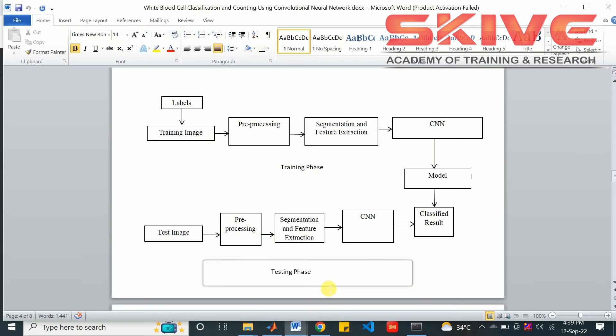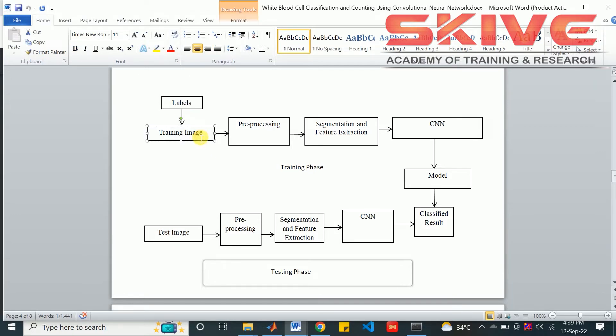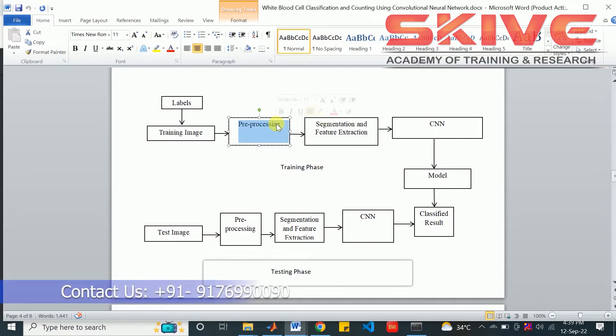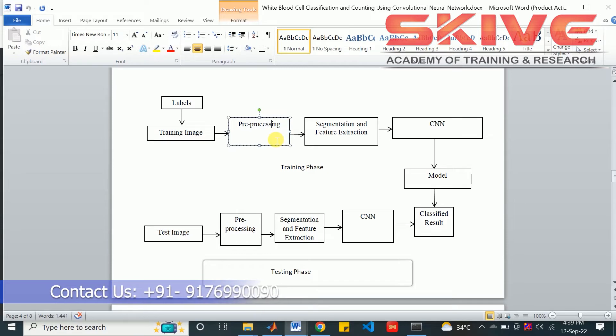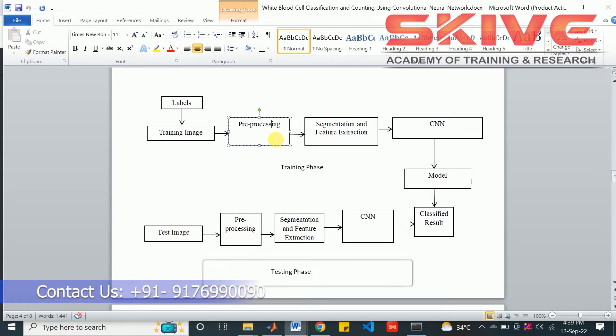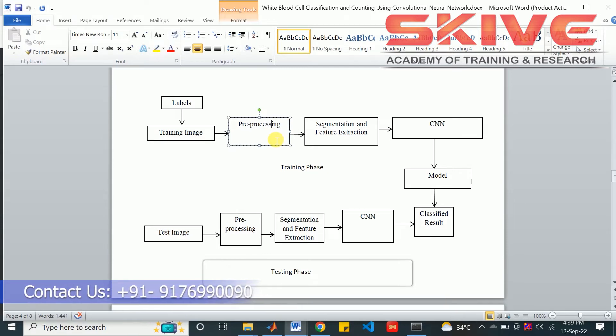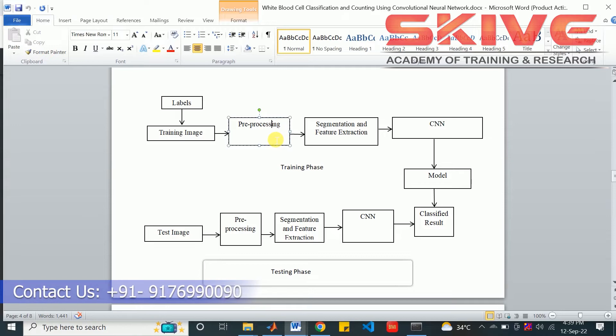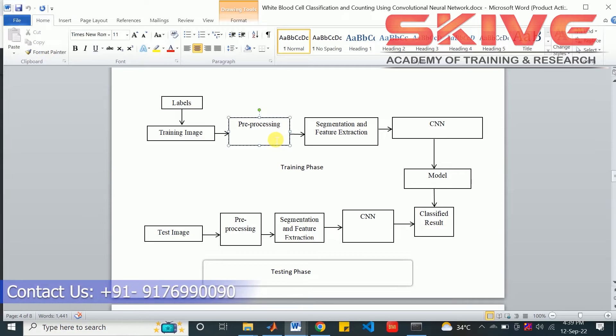This is the basic system of the project. First of all we give the labels and the training image to the system. The first process will be preprocessing - the image will be preprocessed. That can include grayscale conversion, filtering process, noise removal, and some histogram process.